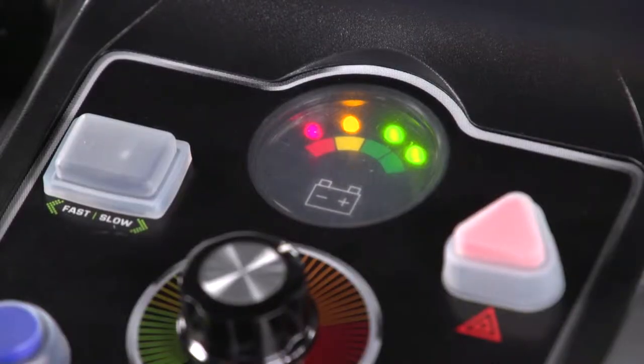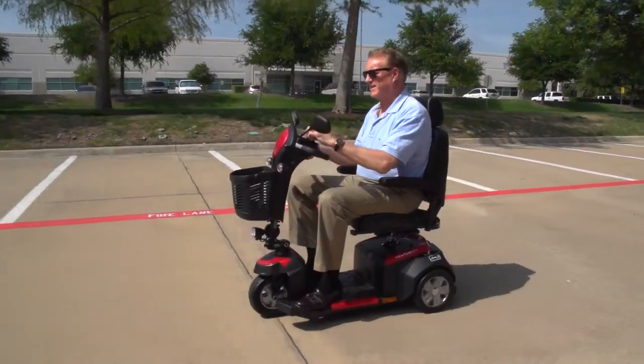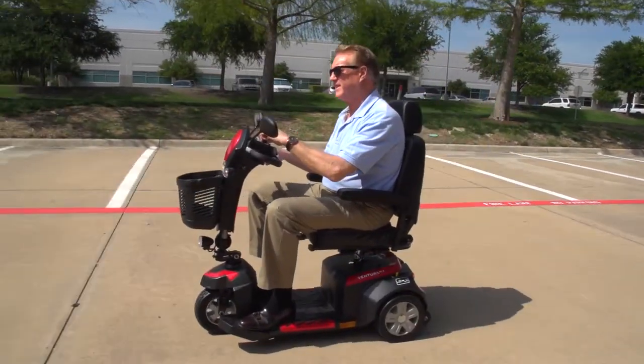And when the battery gauge shows the need for recharging, it's simple via the port on the control panel. Along with great performance, the Ventura offers excellent comfort.